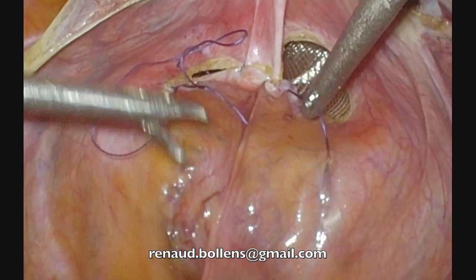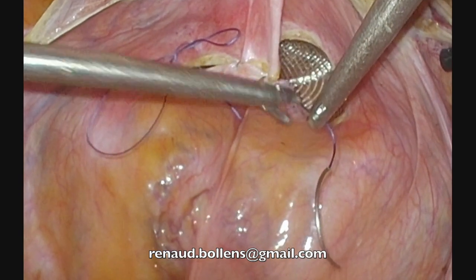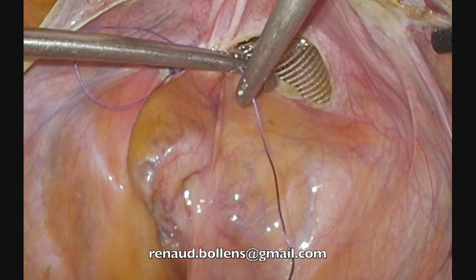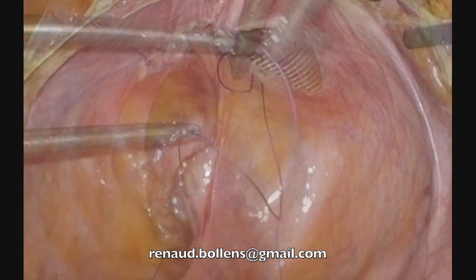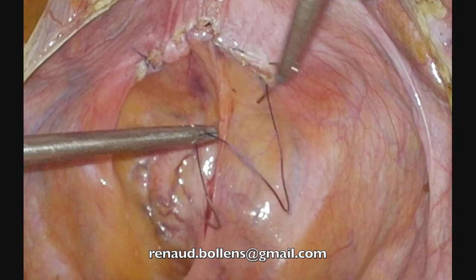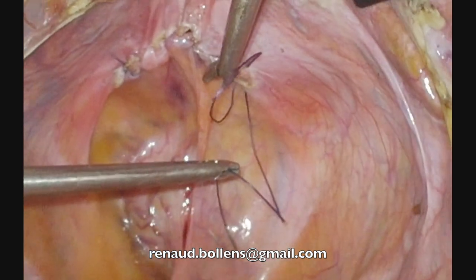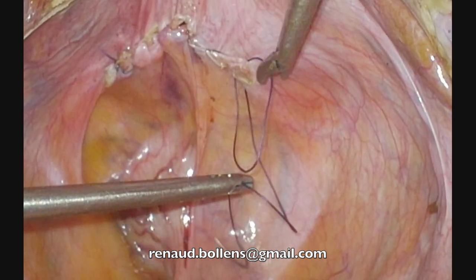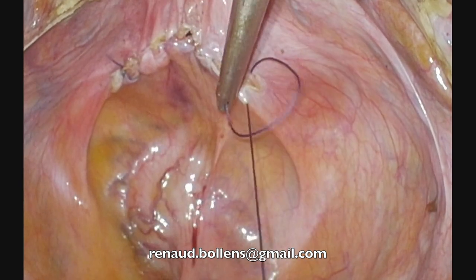And now I can pull. To avoid destroying the peritoneum, I protect the peritoneum with the left needle driver, and I pull with the right. Well, here I have to close the running suture. Then for the first one, I look where the running suture side is. The running suture side is on the other side. This is the running suture side, okay?